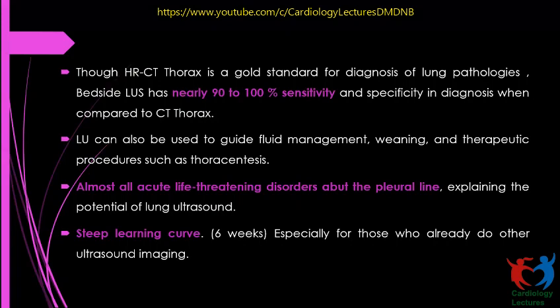You have to put your conclusion from the artifacts. Most of the intensivists, cardiac anesthesiologists, cardiologists, the physicians managing the ICUs, are a little oriented to the transthoracic echoes. They are oriented to the vascular access sort of echocardiography. They know. So if they learn this particular thing, it has a steep learning curve. Usually in 6 weeks you can master this particular thing. So it is very easy to learn also.